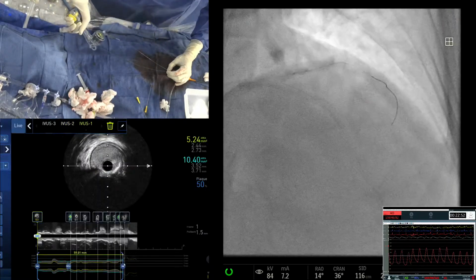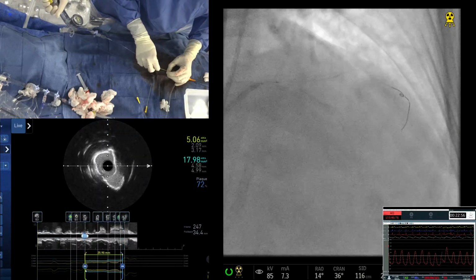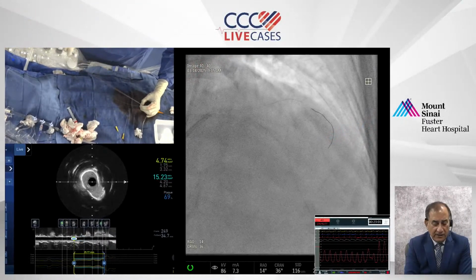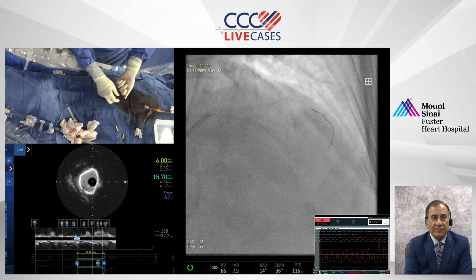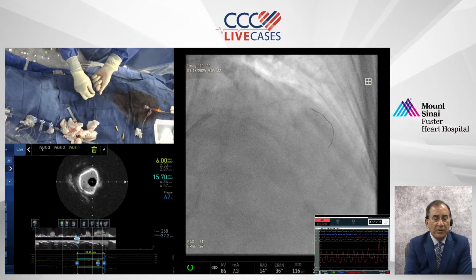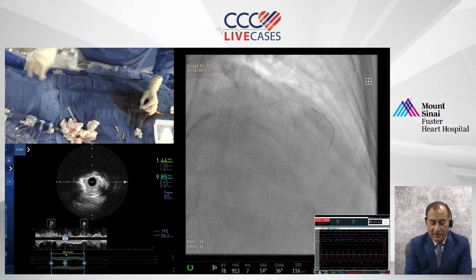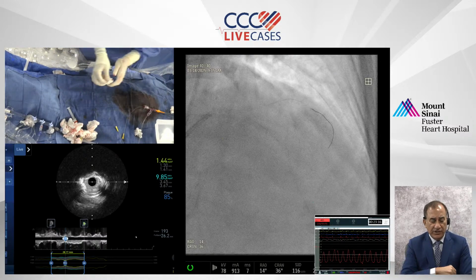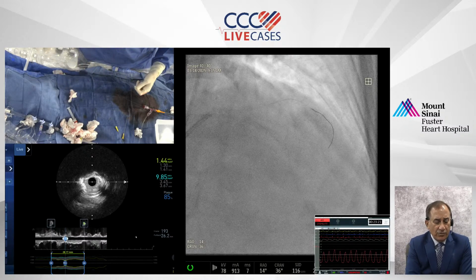Okay, down. Any questions on the decision making here? Just to keep you encouraged, a lot of viewers are all watching intently. A spurt of people joined in the last 10-15 minutes, which I've noticed. It's people who are watching it, and suddenly the case becomes more complex and they get more involved. There is also a very specific question regarding the IVL catheter, which I'd like to ask both of you when Samin and you are there.